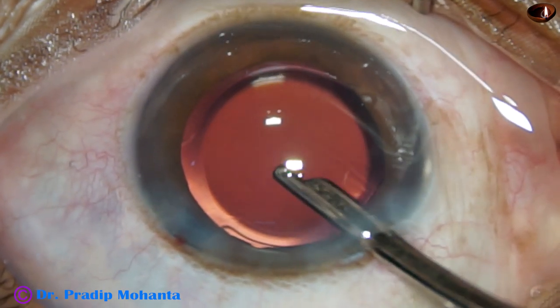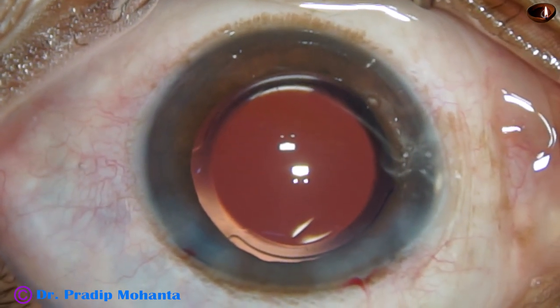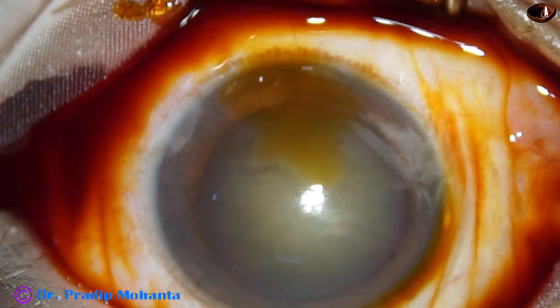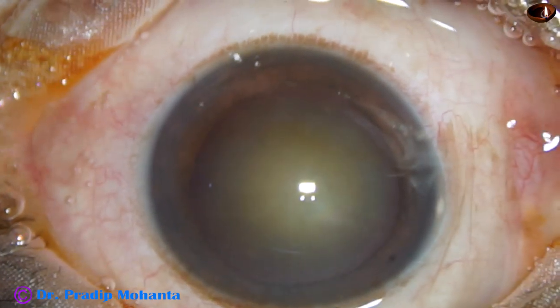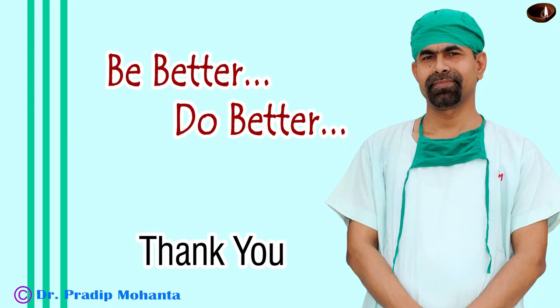Now the anterior chamber is nicely formed. The integrity of the wounds is checked with a cotton-tipped applicator and the case is concluded. Please do not neglect the first step — after instilling a few drops of 5% povidone iodine, irrigate the ocular surface thoroughly with BSS or Ringer's lactate, and then start surgery. Thank you very much for your attention. I hope this video will help you in developing your surgical skills. Be a great surgeon and serve your patients with love, respect, empathy, and great surgical competence.